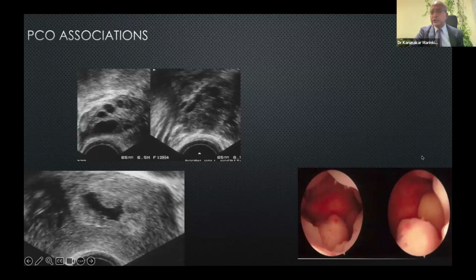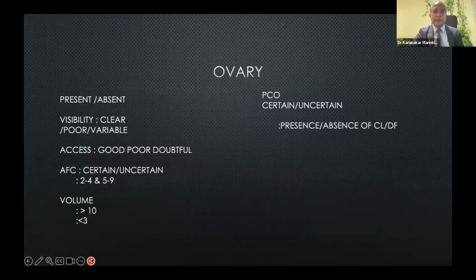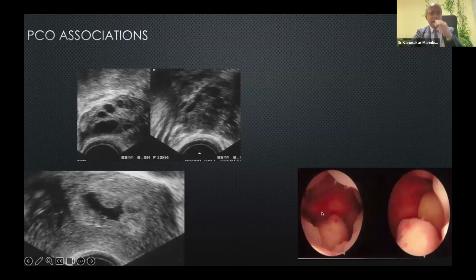Then I did the repeat hysteroscopy. Can you believe this is the repeat hysteroscopy after approximately 9 months of hysteroscopic polypectomy, removal of 9 polyps? So polypoidal endometrium treatment with a knife is not successful. Polyp is different from polypoidal endometrium. Polyp is a one-off pathology, and you remove it, very rarely does it come back. Polypoidal endometrium is a hypertrophic, hypermetabolic state of hyperestrogenic, non-progesterone environment. So you must deal with that separately.